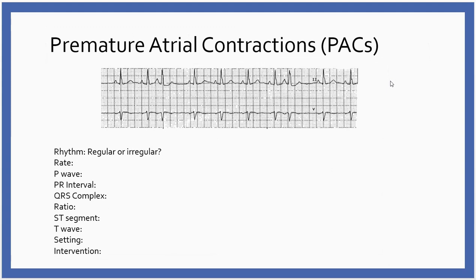So there's a couple things I threw in that are kind of add-ons because you see them frequently. This isn't something that you'll need to know for testing, but when you're out there working, you might see this, and this particular ectopy might be something that you guys have experienced. You may have felt it, maybe not. Premature atrial contractions, or PACs.